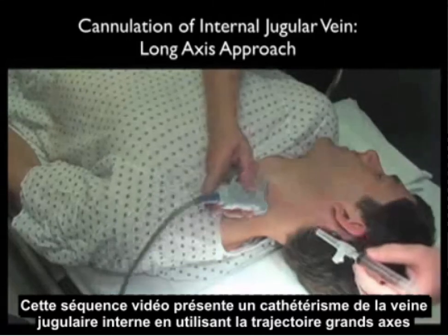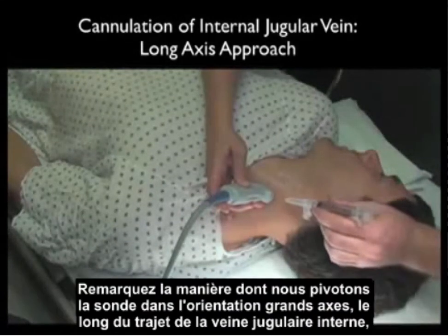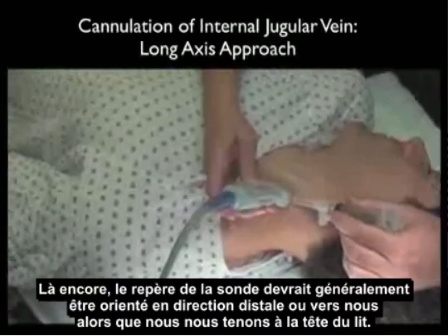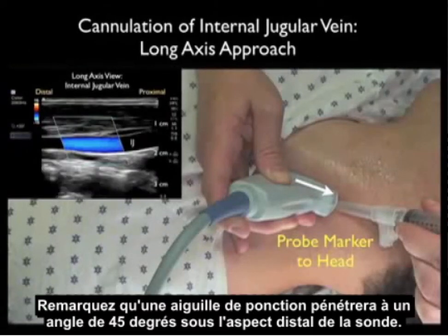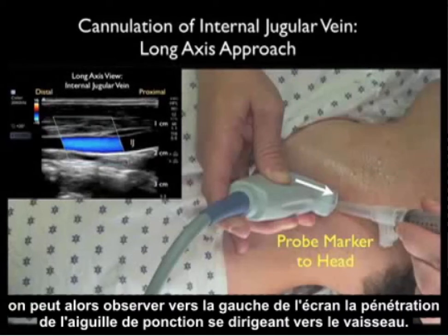This video sequence shows cannulation of the internal jugular vein using the long axis trajectory. Notice we swivel the probe into the long axis orientation along the course of the internal jugular vein as it runs up and down the patient's neck. By convention, the probe marker should be oriented distally or towards us as we stand at the head of the bed. Notice the cannulating needle will come in at a 45 degree angle under the distal aspect of the probe. The distal aspect of the probe or the marker will orient towards the left of the ultrasound screen, so we look towards the left of the screen for the cannulating needle coming down to the vessel.